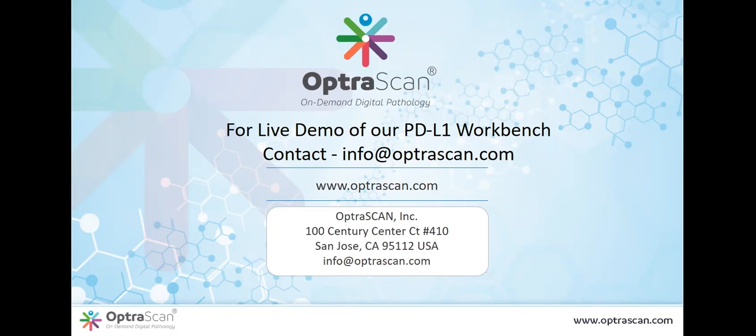Any final thoughts from your end, Dr. Taylor, before we wrap up the presentation? No, I think it's outlined what the algorithm was developed to do and how it was developed. And I'm sure there are additional questions.